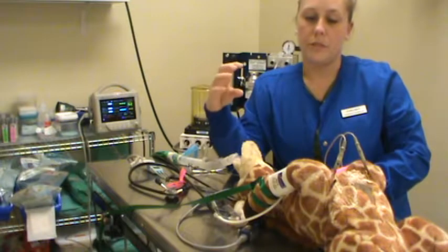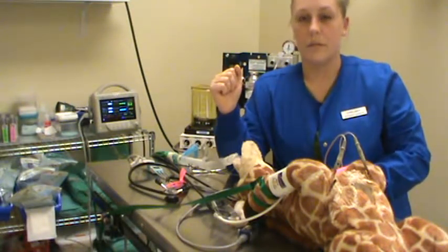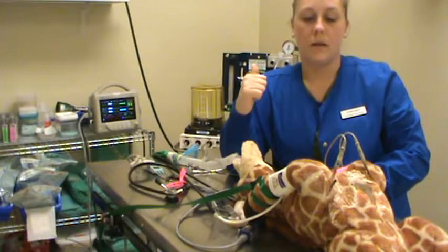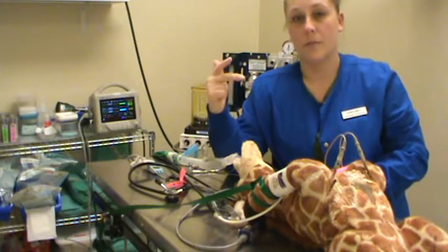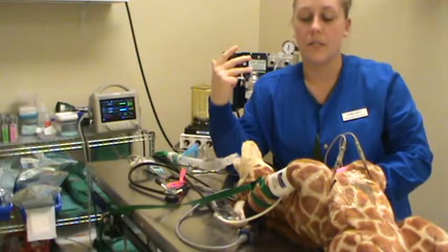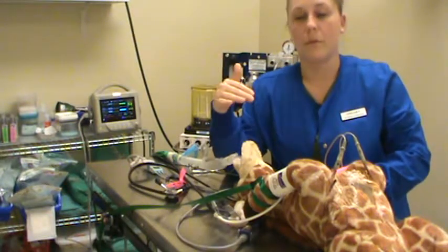All of the isoflurane should be turned off. The ventilating should be turned up. The life-saving measures have already been introduced. So we're doing our CPR, we're doing our epinephrine, we're doing our atropine, we're reversing some drugs. We're trying our hardest to save this patient. But at this plane of anesthesia, plane 4, you probably are not going to get them back.